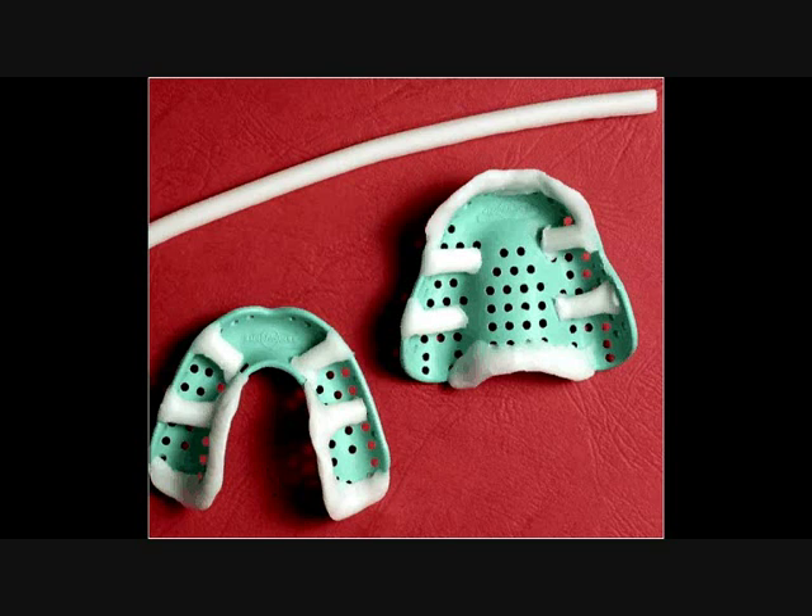For the distolingual fossa, this area must always be recorded in periphery wax as the tray extension will be inadequate to support the impression material. Place the periphery wax on the border of the tray from the region of the pre-mylohyoid fossa and lateral to the border at the region of the retro-mylohyoid fossa.